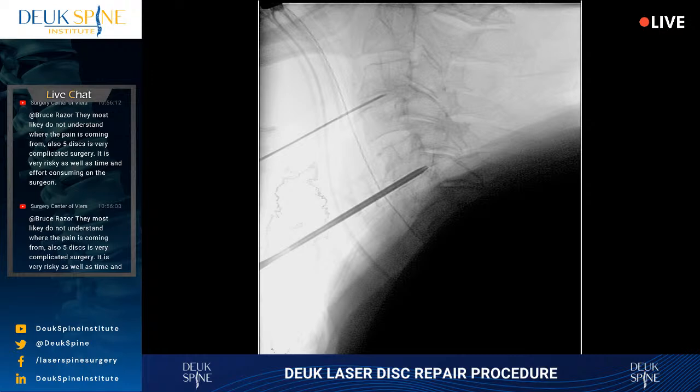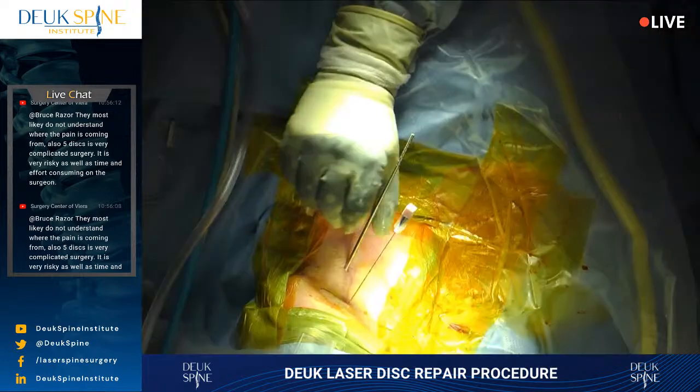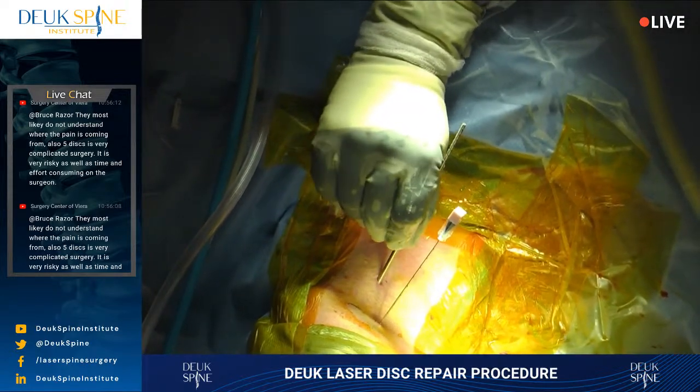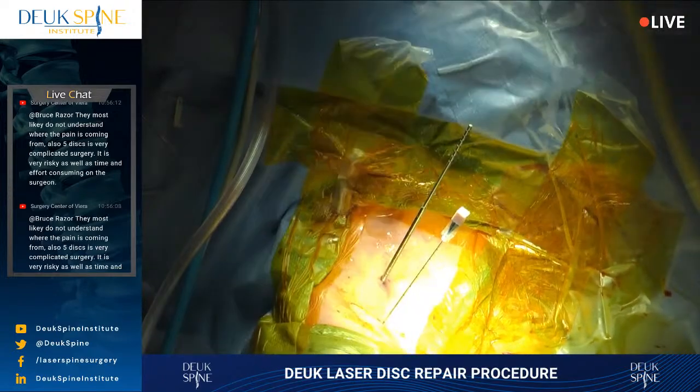No, stay there. We need the tube. For a lot of these patients, the inflammation's been going on inside the disc for years. So the disc is completely degenerated. It's collapsed down. It's lost the nuclear material, the jelly that was supporting it. And the disc is like almost bone on bone, but there's a lot of scar tissue between the end plates from all that inflammation.